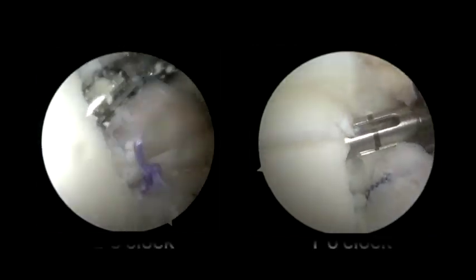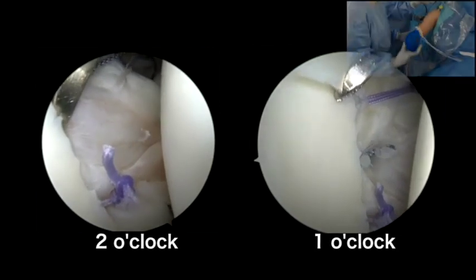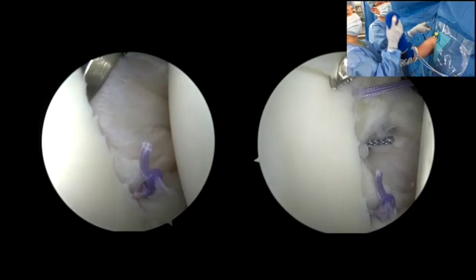These procedures are repeated to repair the anterior superior capsulolabral complex until the 1 to 2 o'clock position.